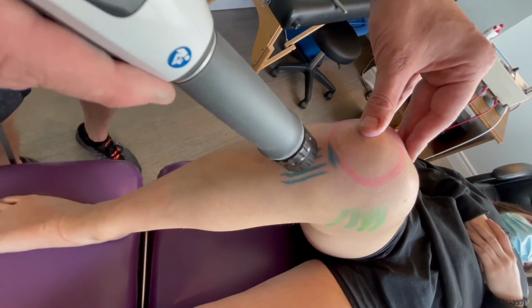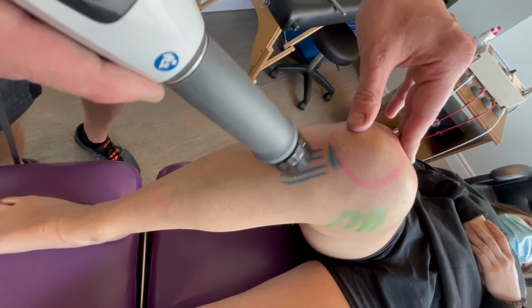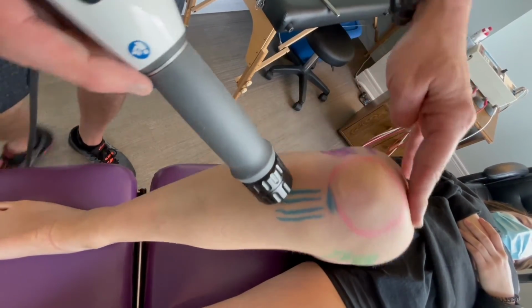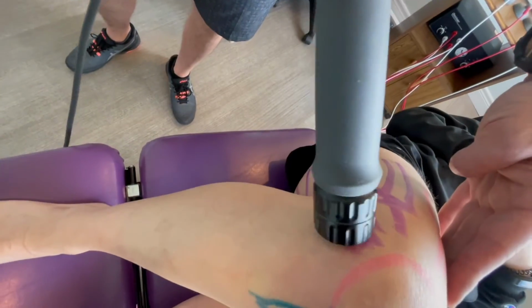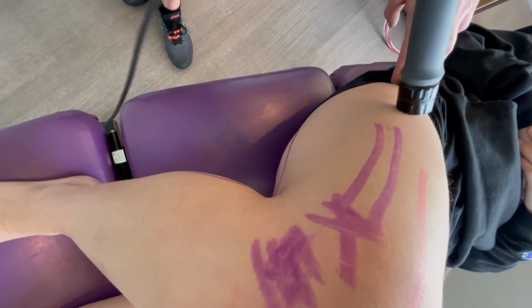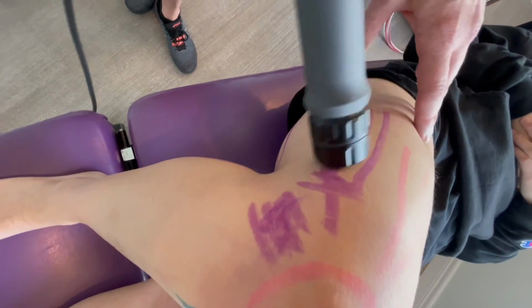Patellar ligament, we come in here. A lot of our kids get this for overactivity. A patient with Osgood-Schlatter's and a big bump in here loves the Shockwave on here. Lateral knee pain would be the same thing as for the meniscus. And then the IT band, we'd run all the way up the leg from the hip and come all the way down. That's the Shockwave for this.